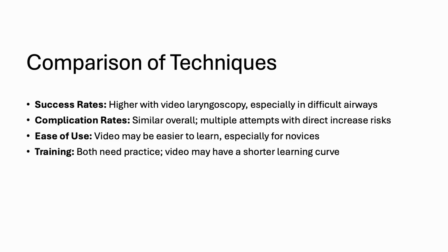Ease of use is interesting. Video laryngoscopy might be more intuitive since you're watching a screen, potentially shortening the learning curve. That said, both require training. The device trial, which we'll cover next, showed video's edge when operators are skilled with it, suggesting experience is a big factor.